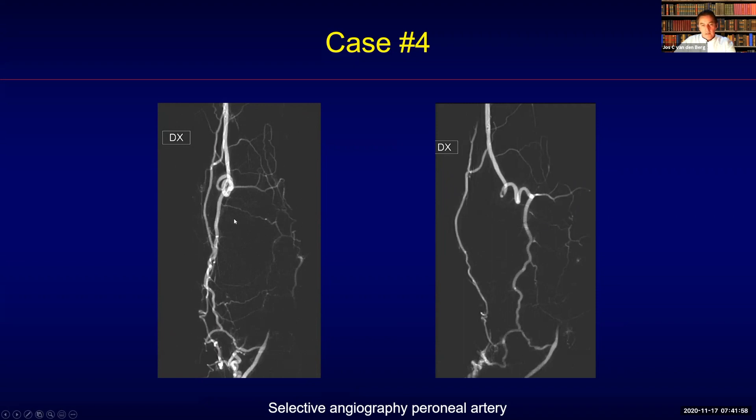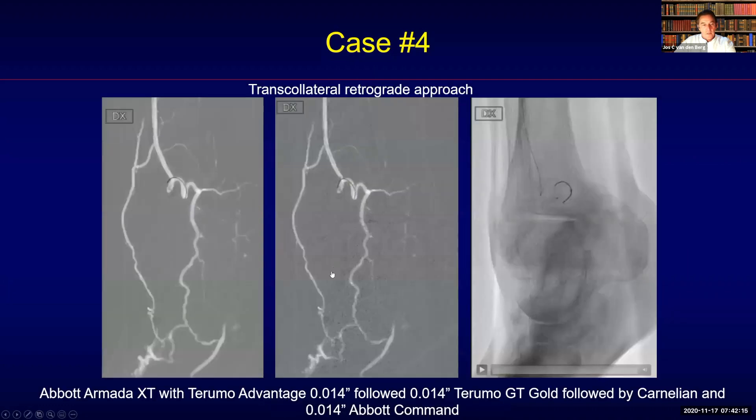Here you can see again the importance of an optimal projection. In one projection it is really impossible to understand which way the guide wire should go, but in the other you have this corkscrew appearance which, although still difficult, allows you to understand where the wire needs to go. I started with an Armada XT with a Terumo Advantage.